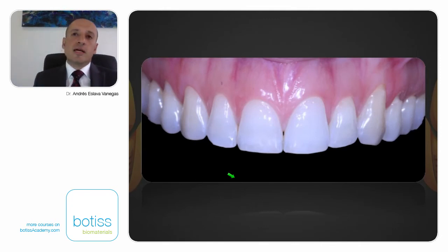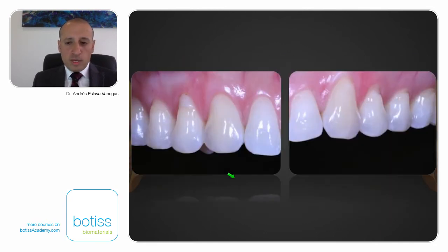Remember Juliana? Juliana was the girl whose parents were dentists. I'm going to show you what the baseline of this case was. You can see here the thin biotype. You can see here the gingival recession of this patient. Can you put the video, please?